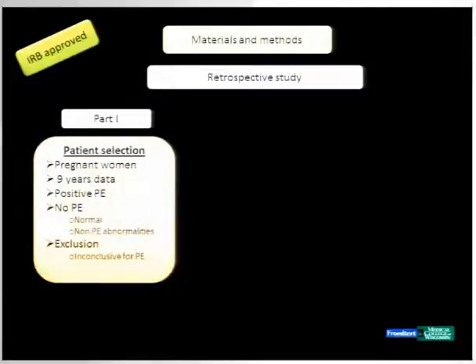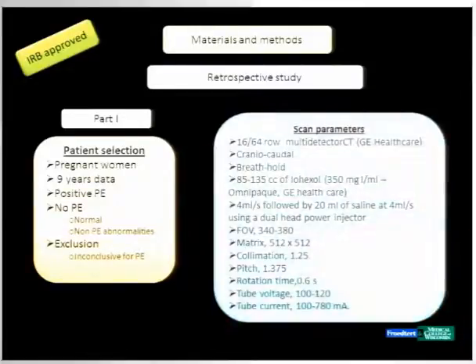In part one, we looked at the data for 9 years, in which all the pregnant women who underwent CTPA exams were identified. Those who had inconclusive studies were excluded. The scan parameters were pretty standard. There was some variation, but most of them had smart mA technology.